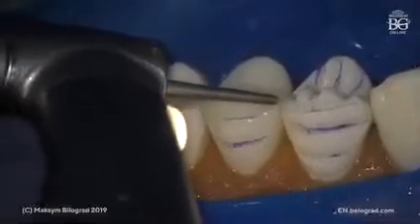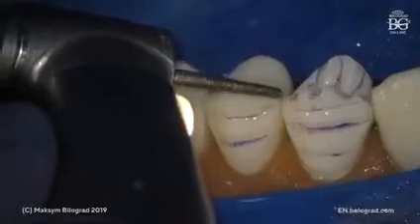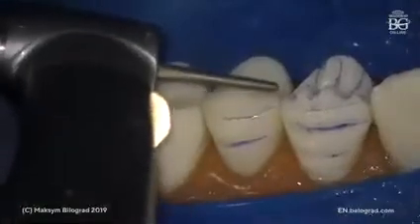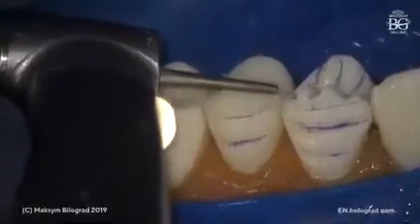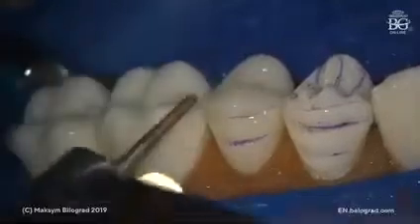Why did I choose that angulation? Because if I do the opposite, for example from the buccal surface to the grooves, I can accidentally move my burr to the occlusal surface, and I don't want that. I want to keep my burr straight over the tips of the cusps that we have already marked, and we will have a butt joint.